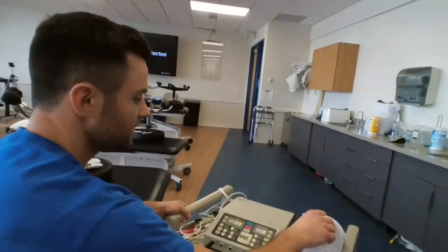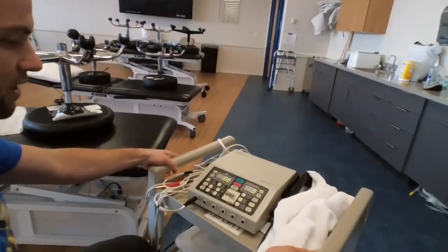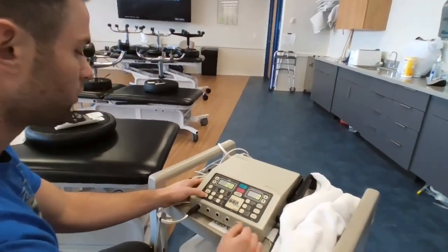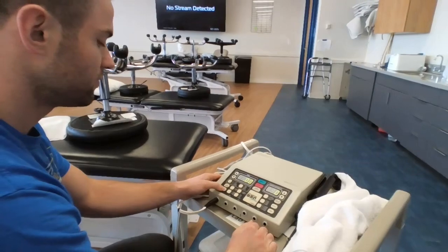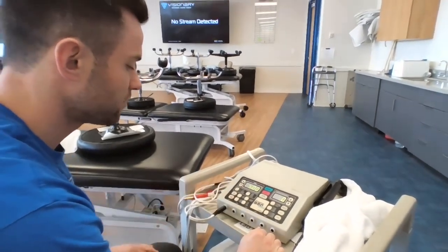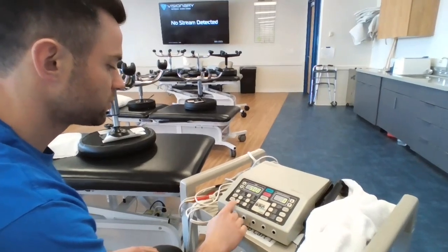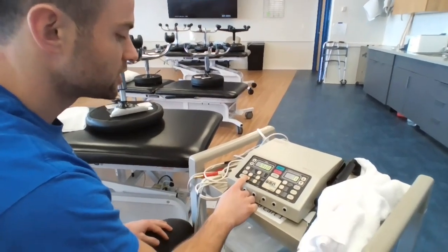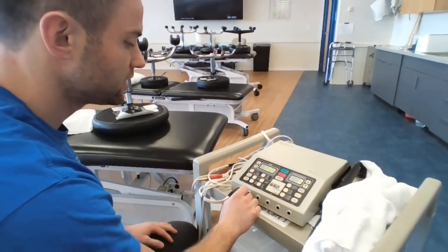So, since Ronnie is in the acute phase of healing, we don't want to apply any heat or thermal properties into the injury site. So we're going to go ahead and just hit this sound button. And since we're on the lateral malleolus, it's kind of a shallow area. So we're going to set the machine to 3 megahertz.